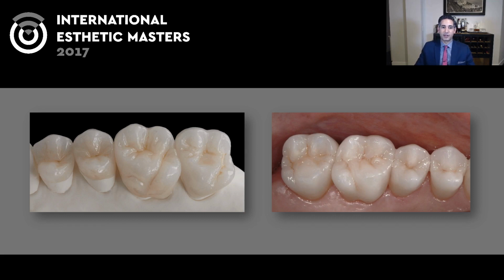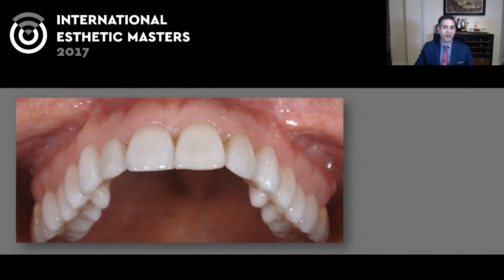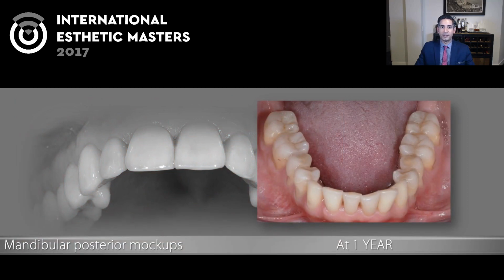Here's the final restorations that are on the model and in the mouth. Close-ups of these final restorations. These are done by Michelle Monnier, and this whole case was done by Michelle for the lab work. And here's the final completed upper. At this stage, it's been about 1 year, and the patient is in these lower provisionals, which are those bonded mock-ups that we talked about. You can see that there's been a little bit of wear, but everything's holding up very nicely. So it's not something that we had to replace throughout the whole duration of a year. That stayed in place, and we didn't have to make any changes.